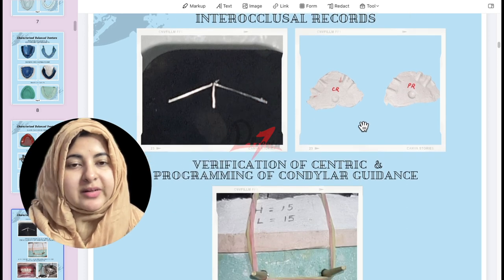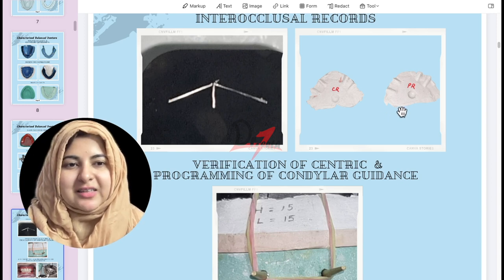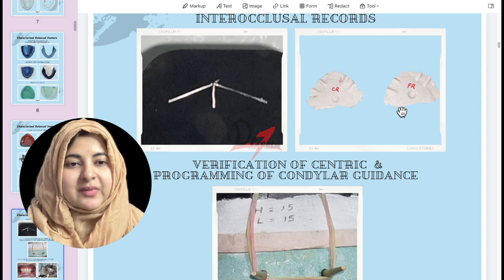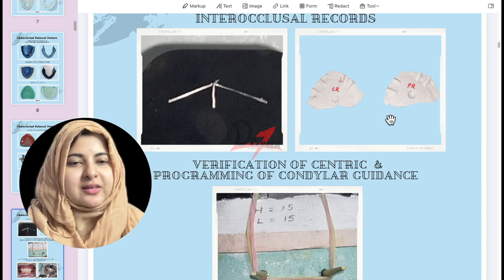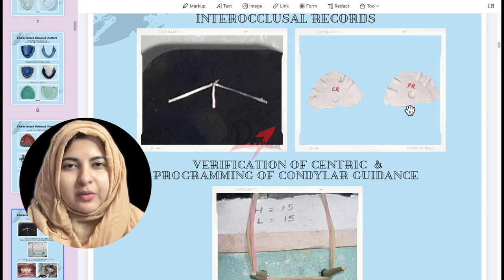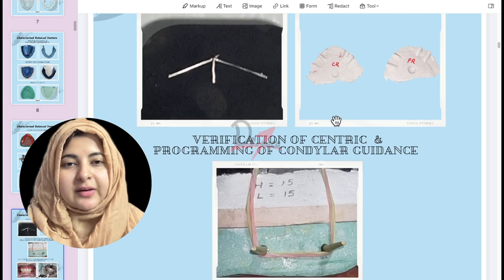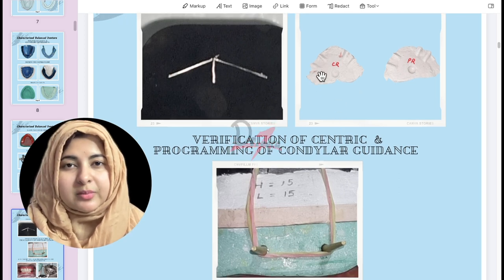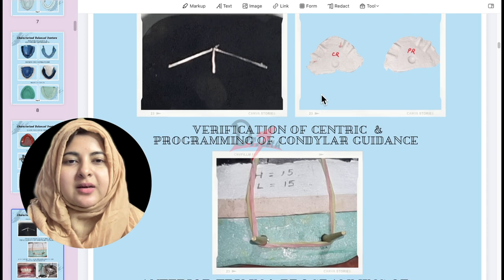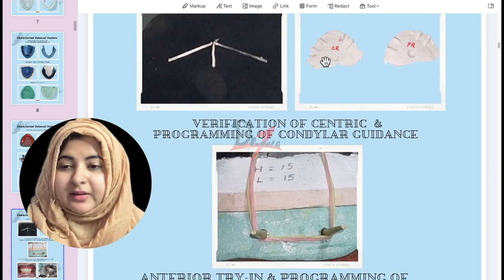We then make two records: one centric record and one protrusive record. A debatable topic is whether the protrusive record should be perforated or not. My view is both should be perforated, because the patient bites down on the point and then protrudes forward. For the centric record there is no doubt — it should be perforated so the vertical dimension is maintained.